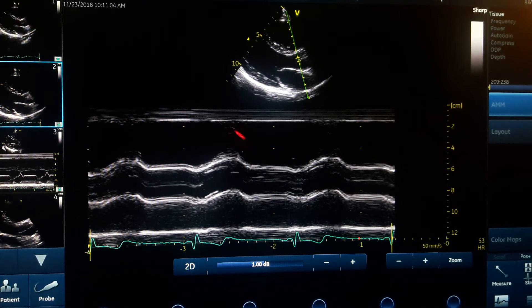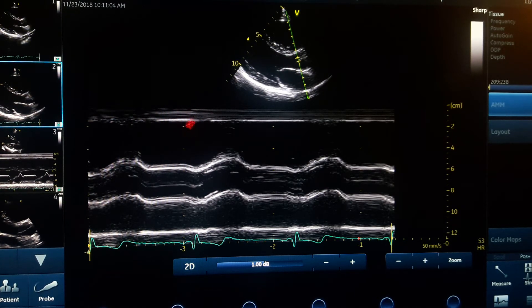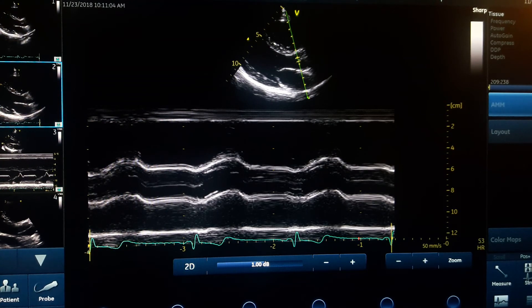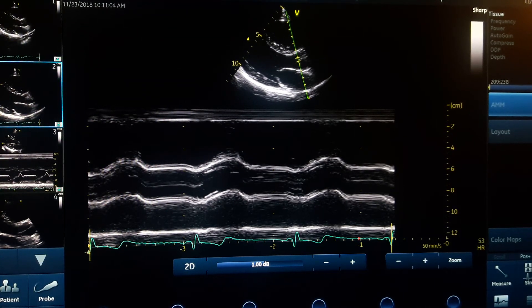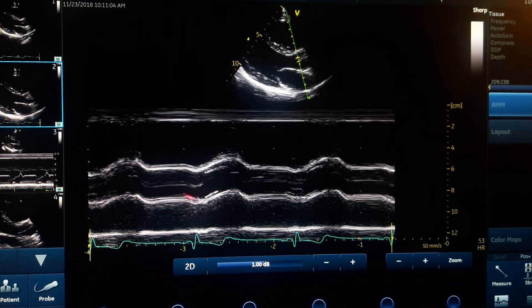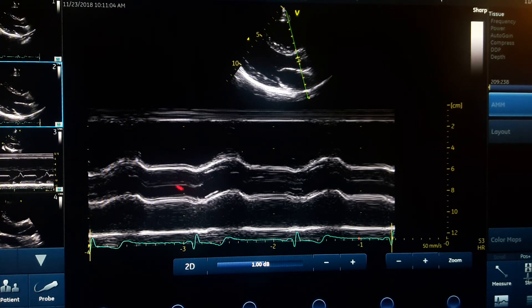On the aortic valve M-mode during diastole, both cusps — the right coronary cusp and non-coronary cusp — are in contact and close to each other. We will see coaptation as one line on the diastolic phase, from end of T wave to Q. Then as systole starts and the aortic valve begins opening, the leaflets open and the right coronary cusp contacts the anterior wall of the aorta.